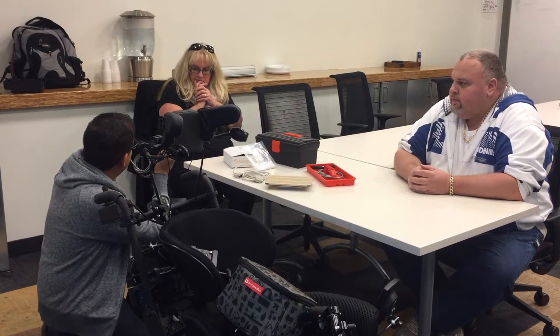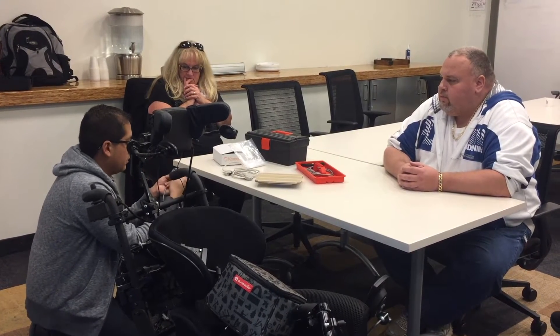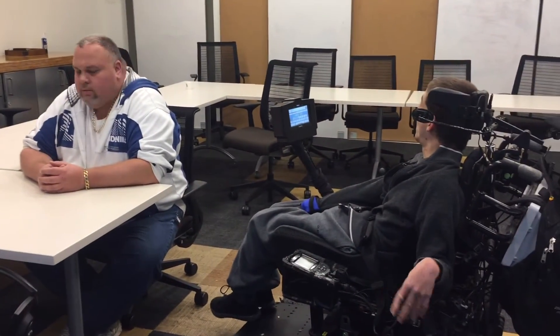What the splitter cable does is allows you to connect four separate devices to each of the four independent splitter cable switch connectors. By using the splitter cable, we ensured that Marshall could use the other switch connectors to plug in his communication devices or other devices he controls through his wheelchair.